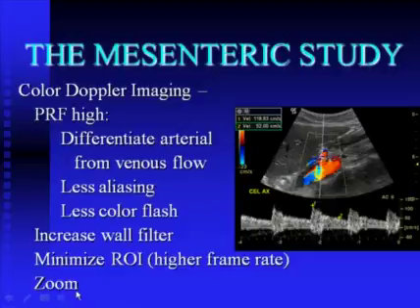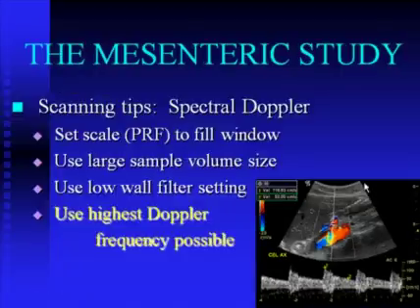Also, don't forget your zoom feature. It's much easier to see a relatively large target than a small target. So once you've identified where the vessels are and you know where you're going to interrogate these vessels, feel free to zoom up on that site and use that to help you.